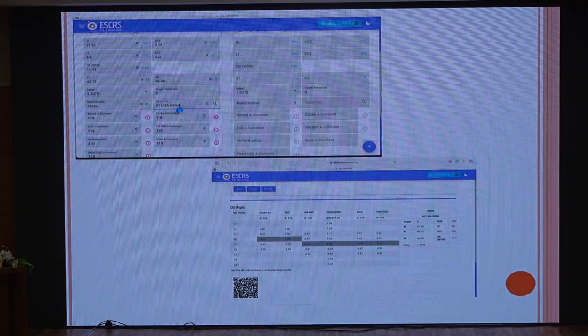Like here you can see, when you do all this, the power of the lens comes here. So you can choose the power based on your experience, whether you need the upper one or the lower one. All the 7 formulas are giving you the power in one go. Then you can put in the lens based on your experience. If you are getting a little more myopic, you can go for a little more hypermetropia, or if it is hypermetropia, you can go a little bit more towards the myopia.